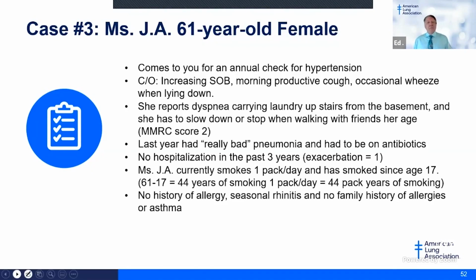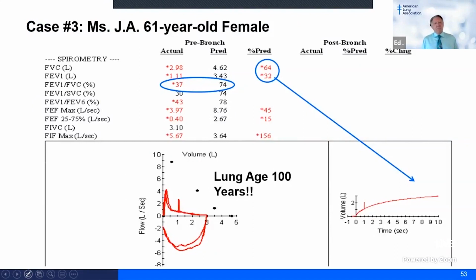All right, this is her PFTs. Interesting enough, in the pulmonary function lab, a big study suggested that the vast majority of people, when they're first identified with COPD, have lost more than half of their lung function, right? We're not being very good about finding this disease early because we have lots of extra lung, right? Expiratory reserve volume and extra inspiratory capacity, so we can do exercise. And if you're fairly sedentary, you can lose half of your lung function without really even noticing a difference.